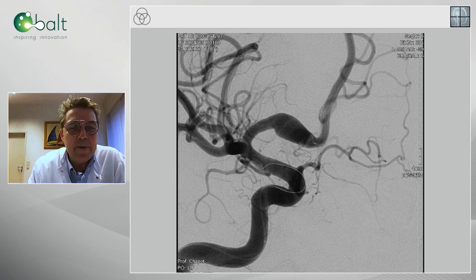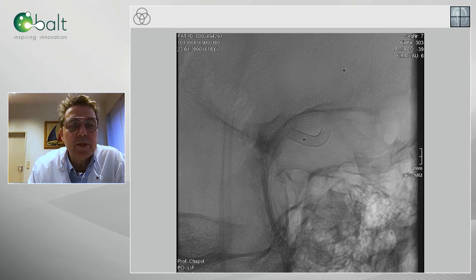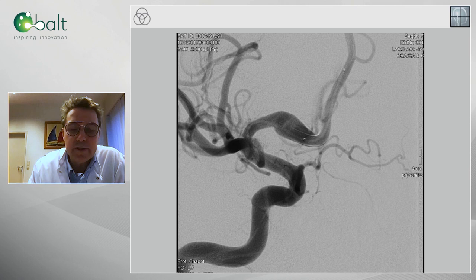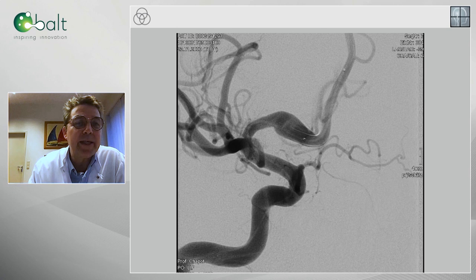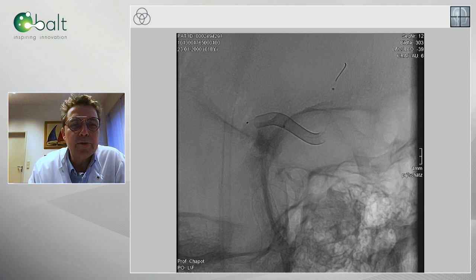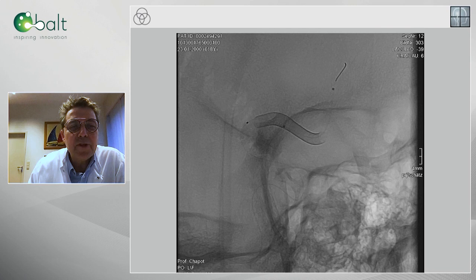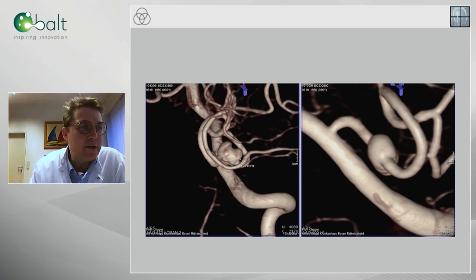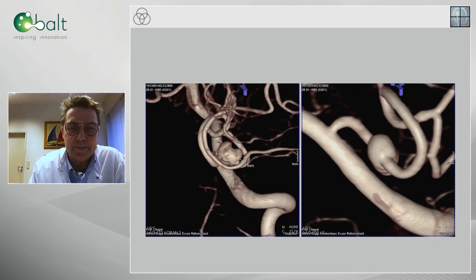Here we go through some examples. It was with the baby — this fusiform aneurysm, one of the first we retreated. The device is of course a bit short, but you can telescope. The main advantage of having smaller microcatheters is that re-entering through the flow diverter lattice is much easier because you have less chance of the microcatheter being caught at the entry of the stent. We progressively entered and placed three in telescopic fashion. You can appreciate by the color how much stent has been placed. That was the immediate result, and we should have a follow-up which shows a cure after a couple of months.